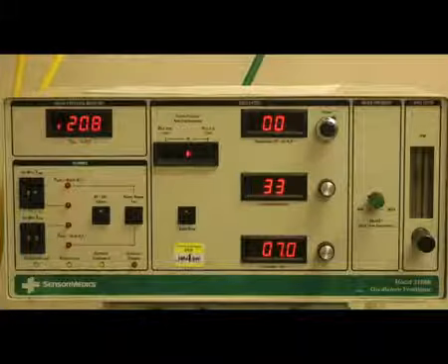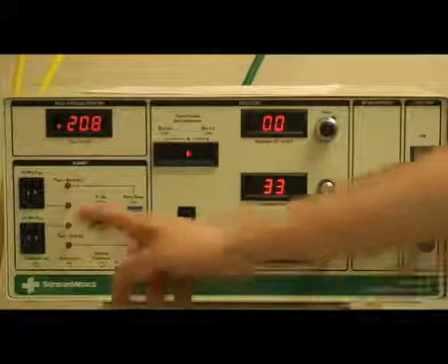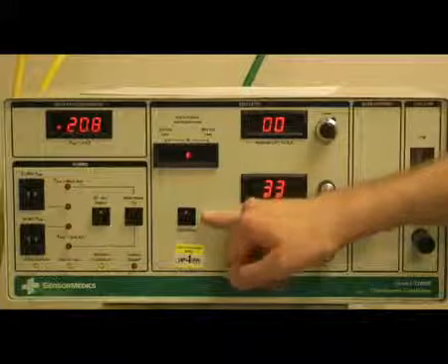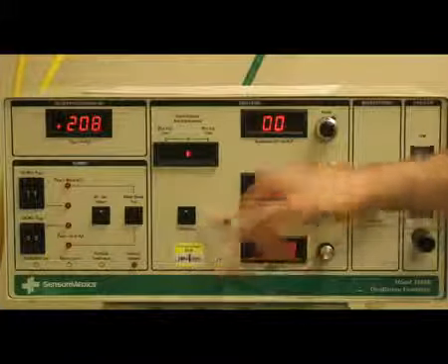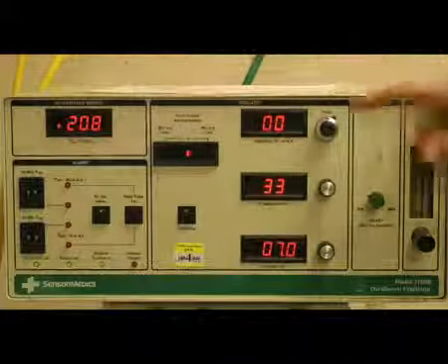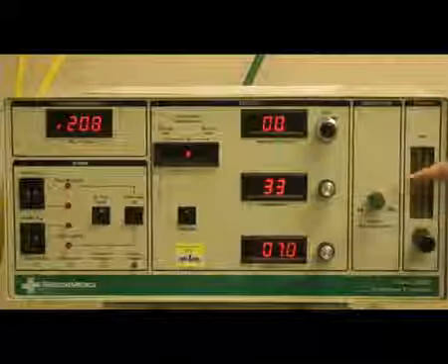To begin a recruitment maneuver, you need to set your high mean airway pressure alarm to 55 centimeters of water pressure. You'll also want to turn off the piston, which is done by depressing the start-stop button on the oscillator. You will then raise your mean airway pressure to 45 centimeters of water pressure via the knob on the right next to the bias flow.